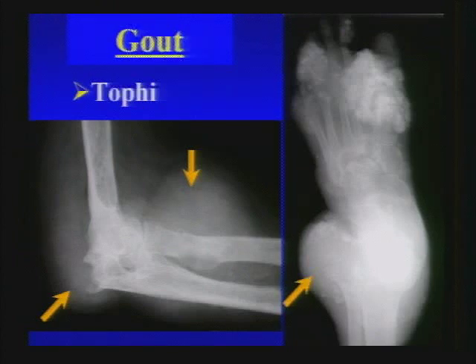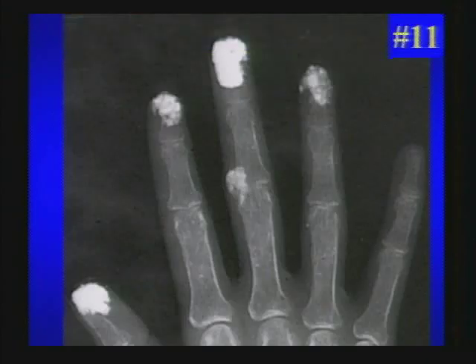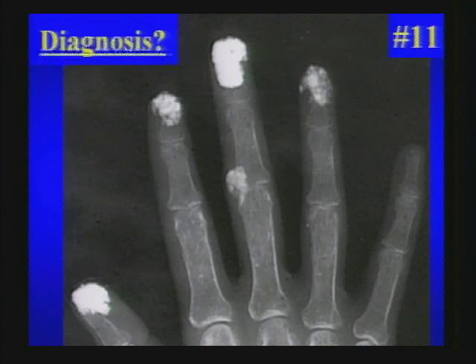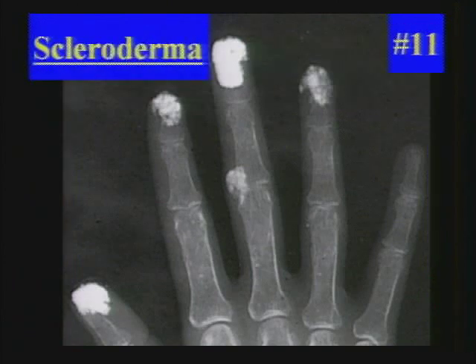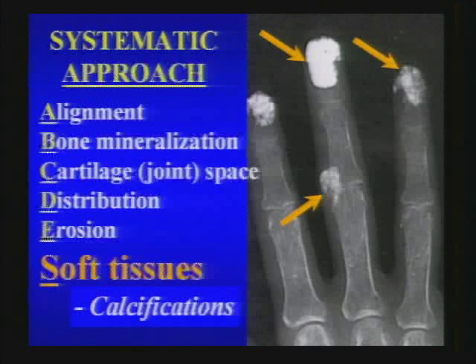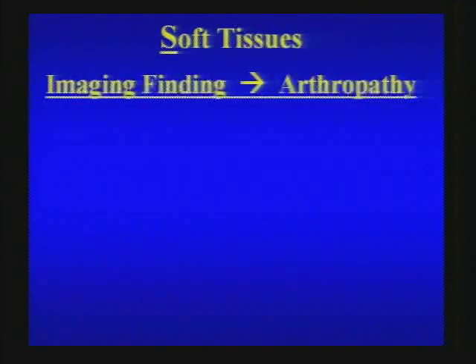Sometimes gouty tophi calcify — a characteristic appearance. Here, another type of calcification affecting the acral regions with some soft tissue loss distally — scleroderma. This brings up soft tissue calcifications and how they can help limit a differential diagnosis or make a specific diagnosis.